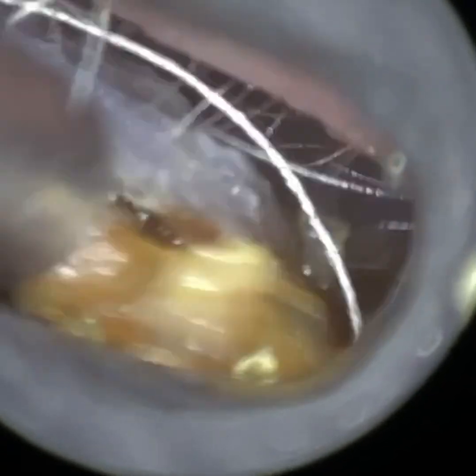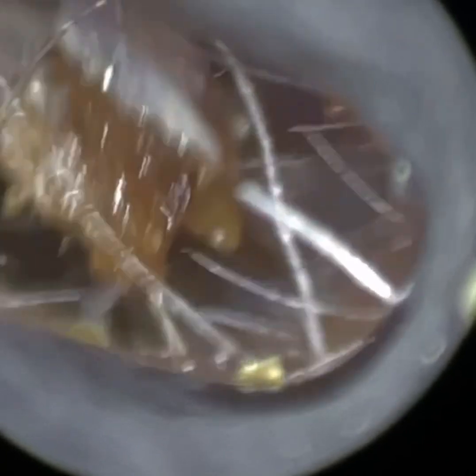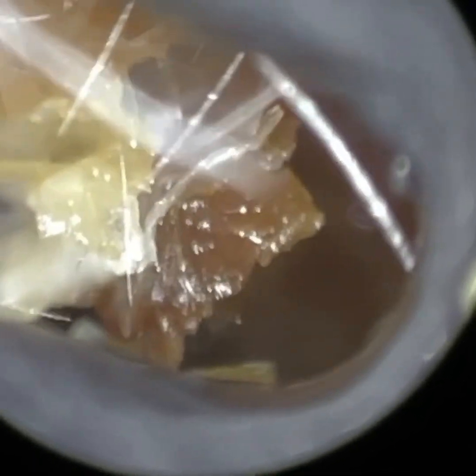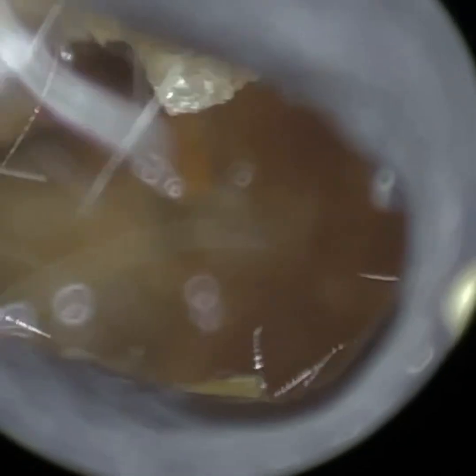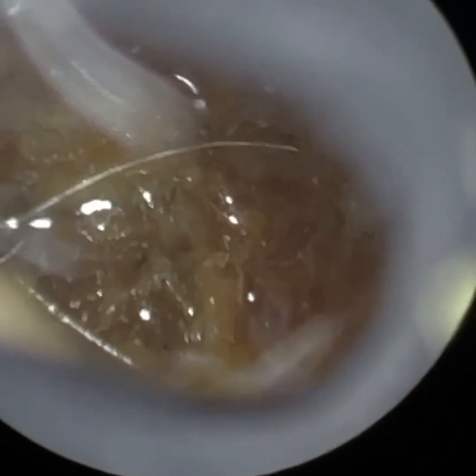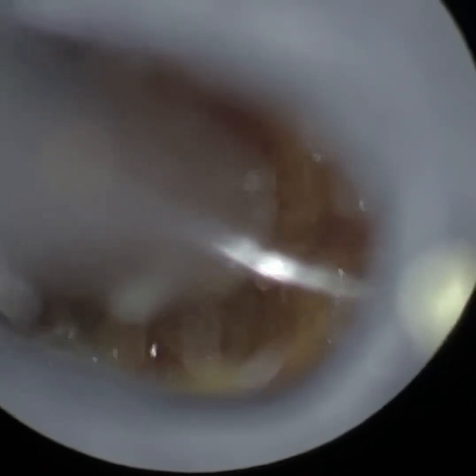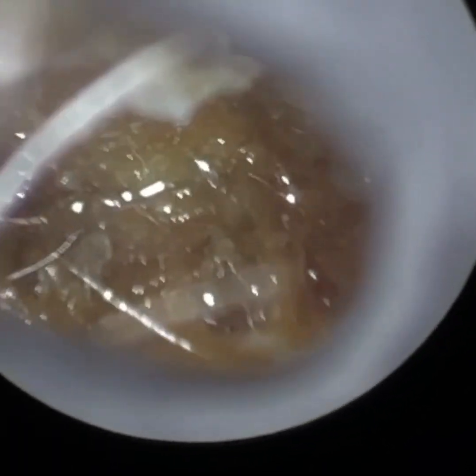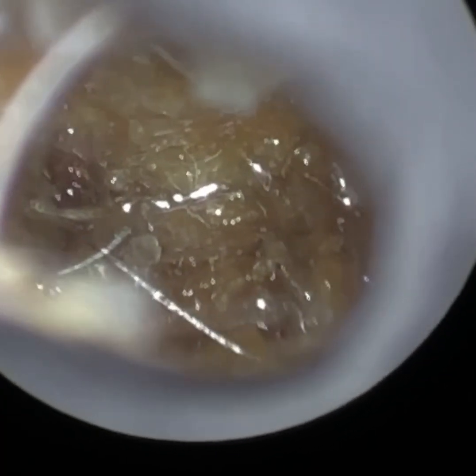The speculum we're using here — these are not our finished product, just prototypes. They are getting injection moulded, so they're going to be even better. The prototype speculum is a bit thicker than it will be with the final product, so even with this smaller 3.5mm speculum we're hoping you'll actually see less of the speculum once we have the final product. With the 5mm speculum — I did a procedure yesterday uploaded to LinkedIn and the Clearwax YouTube channel — the patient had a slightly larger ear canal and you weren't able to see the speculum at all. I like the idea of seeing some of the speculum though because it helps guide you in the ear and you can almost use it as a guide to help focus the Waxscope.